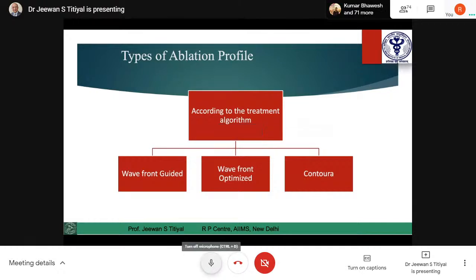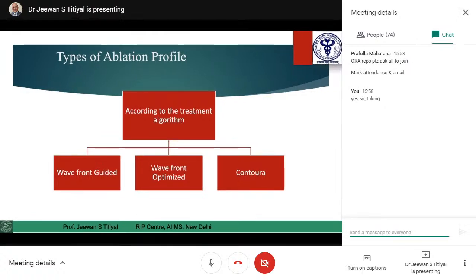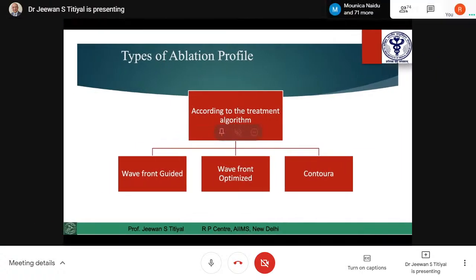That is also something I can't tell you exactly. I have to see that slide again. But the important thing is how we calculate the amount of ablation going to happen in terms of per diopter. Each diopter will have a particular amount of tissue to be ablated from the cornea. So it will depend on various parameters. If you want, I can go back to that slide.